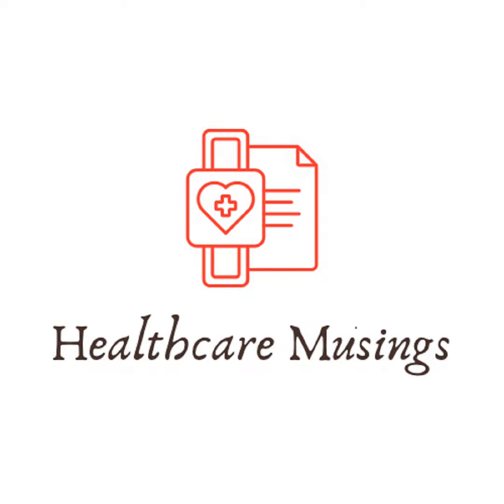Pressure support's not there because there's no spontaneous breathing. They're generally anesthetized and paralyzed. They're not going to take any spontaneous breaths. So SIMV in the OR looks like assist control. Okay? So yeah, everybody in the OR puts that on SIMV, but it's the same as assist control.